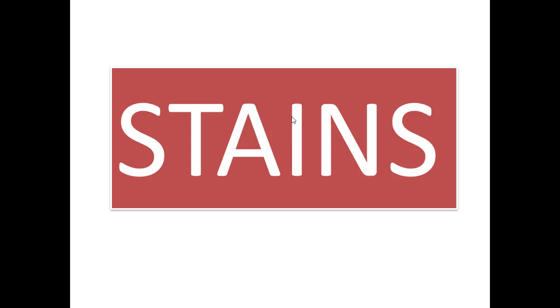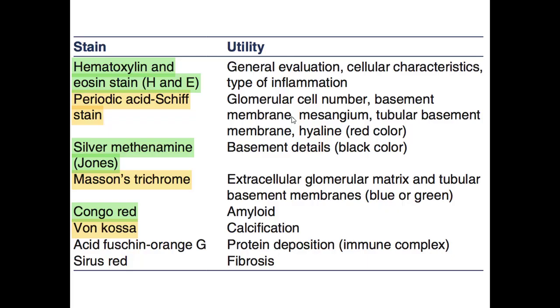The kidney sample, or the renal sample, should be stained with multiple stains. Why? Because I have different structures in the glomerular capillary. I have membranes, I have mesangium, I have cells, I have tubules. So each stain will discriminate some structures and some changes, which help us in the final diagnosis. We have those stains, but the most common are hematoxylin and eosin, periodic acid Schiff, silver stain, and Masson trichrome stain. Those are the most important.